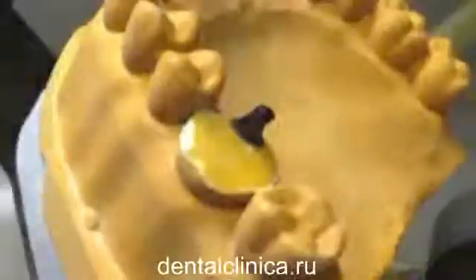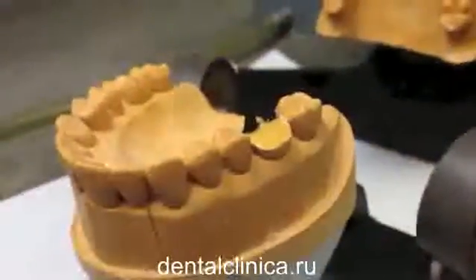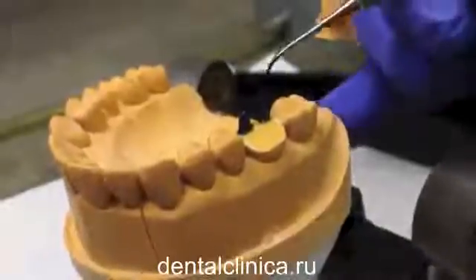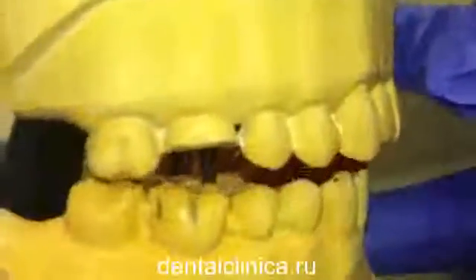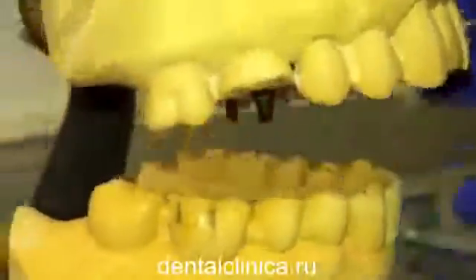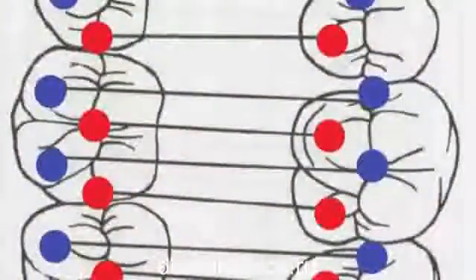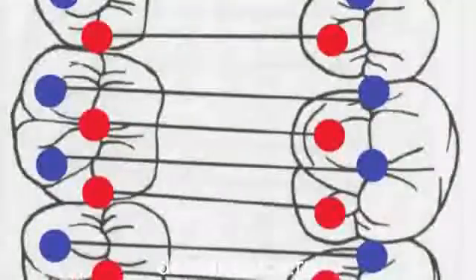Once the first cone is done, the second cone, which represents the distal lingual cusp of tooth number 3, will be made. Remember to frequently check that the cone is meeting in the proper receiving area. This photo shows how cusps are related to their receiving areas.